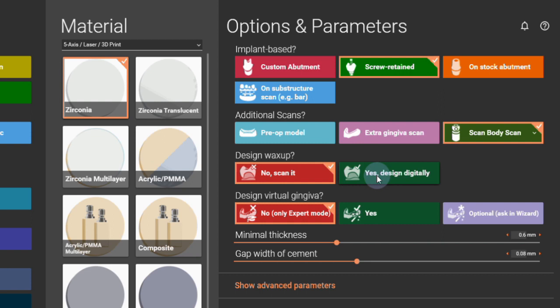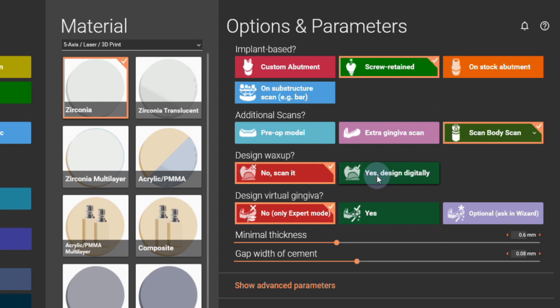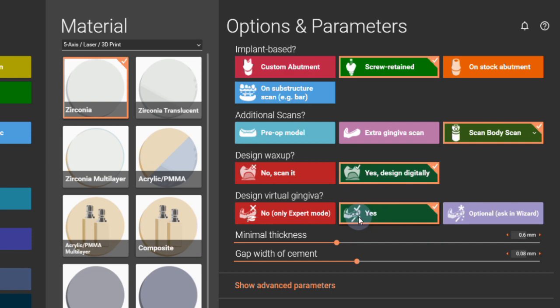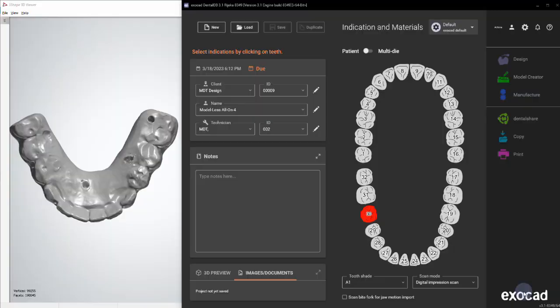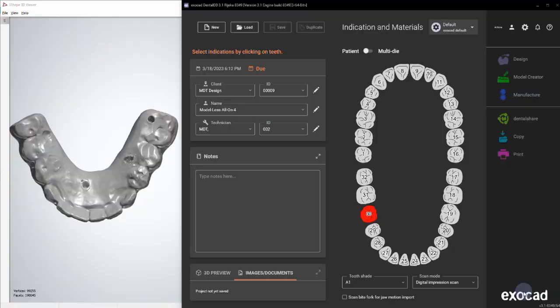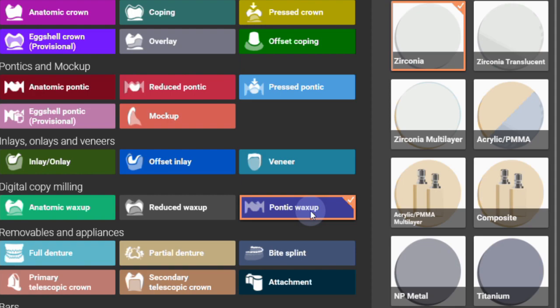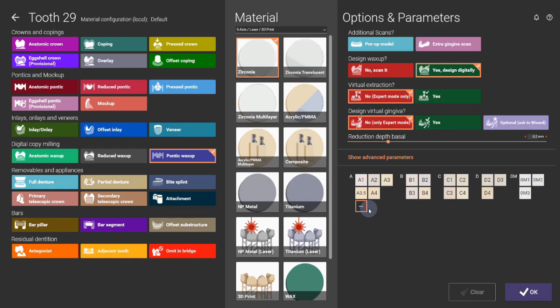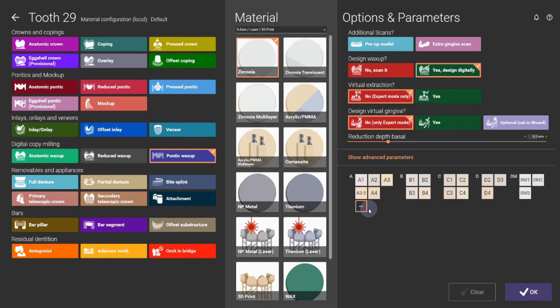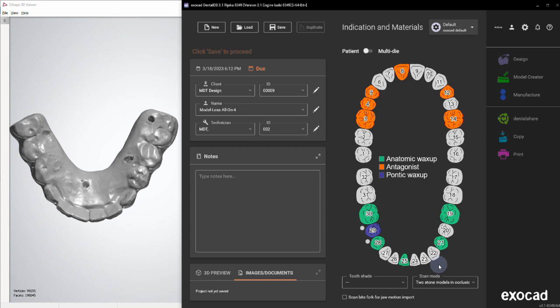In the beginning, we're going to start with the order form. I'm going to select the first two, so it's part of the design. I'm going to click anatomic wax-up and zirconia in this case. It doesn't really matter what you choose—screw retained. I have a scan body scan available. Yes, I'm designing it digitally and I want to design the gingiva as well. I also have a pre-op model, so I'm selecting this.